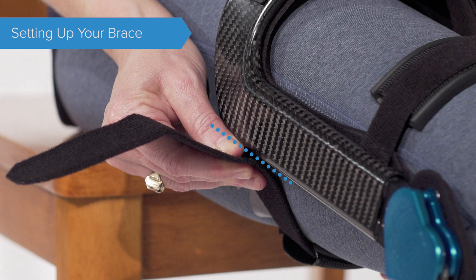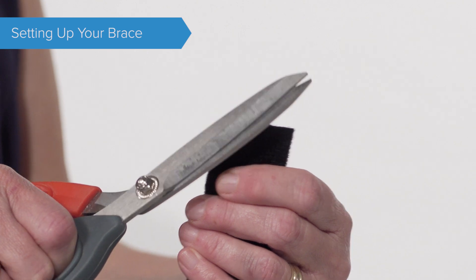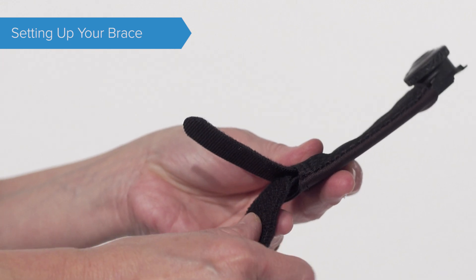Measure twice, cut once. Using your scissors, cut the strap along the line and then round the edges. Reattach the velcro straps, ensuring the tensioning knob is facing away from the brace shell.